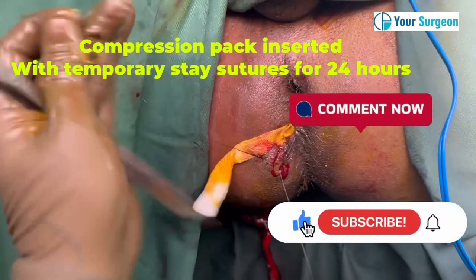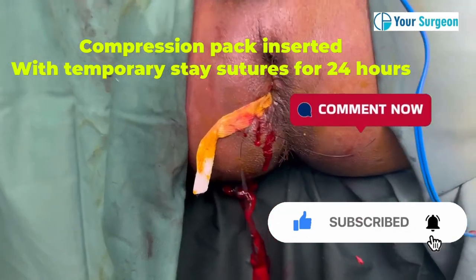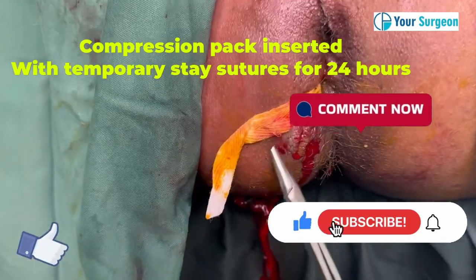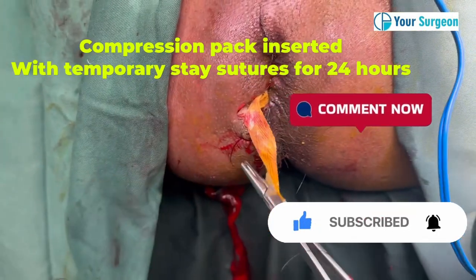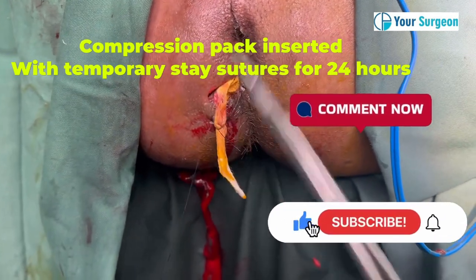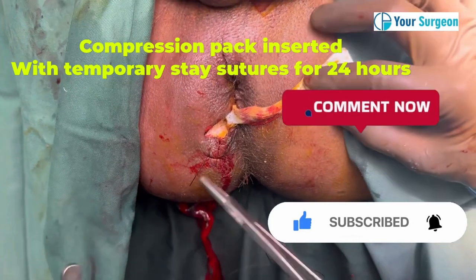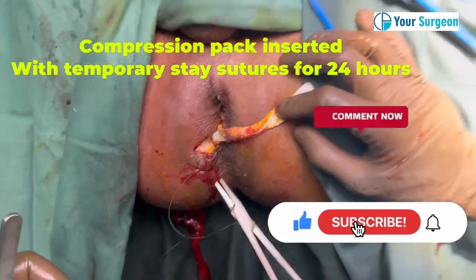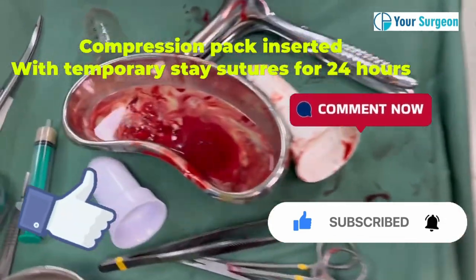This video is very helpful for beginners, colleagues, and people who are contemplating or have already undergone abscess surgery. It provides insights into the basic principles of perianal abscess drainage, avoiding fistula formation, and achieving adequate drainage by performing a fistulotomy simultaneously.